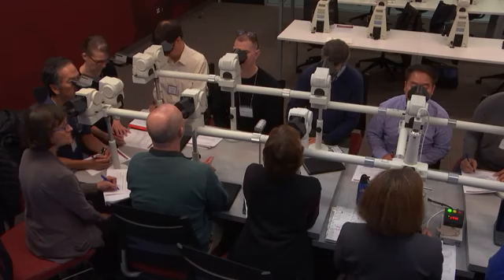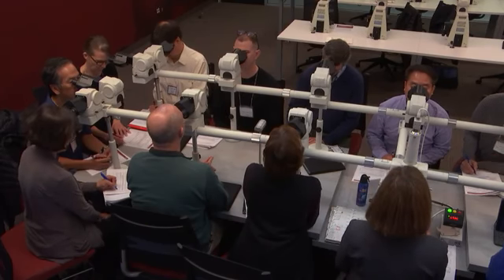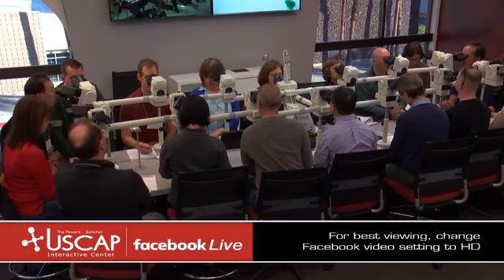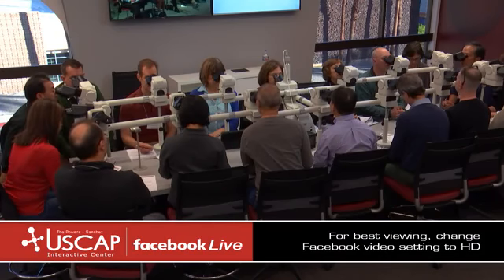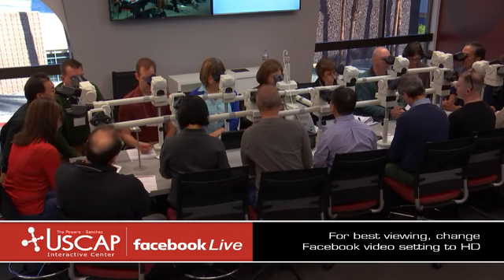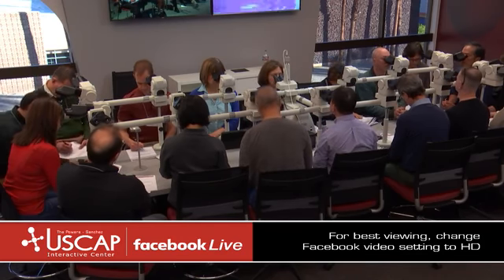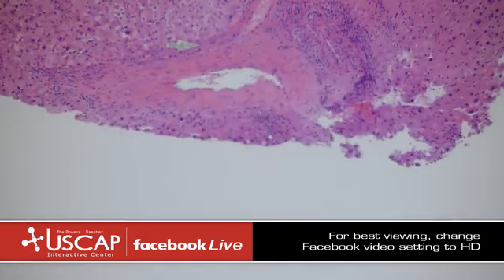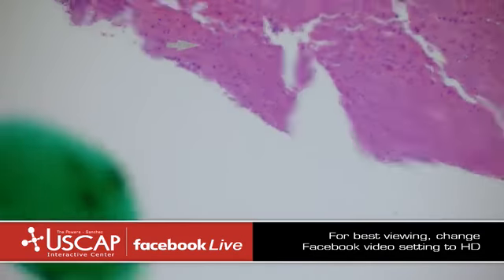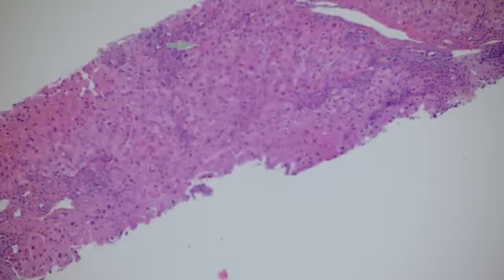So yes, cyanamide poisoning, some storage disorders, Lafora bodies, anything that revs up cytochrome P450, polypharmacy. I've seen this in patients who are on multiple drugs, kind of pseudo ground glass. So beware of that. But yeah, you've got a clue here. You've got a chronic hepatitis pattern, right? So a different, or similar, differential, but a little different.